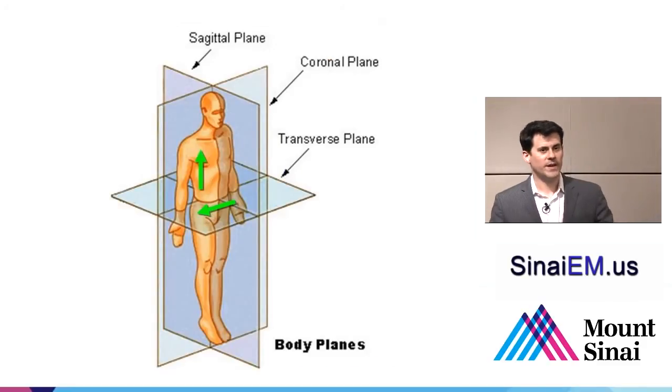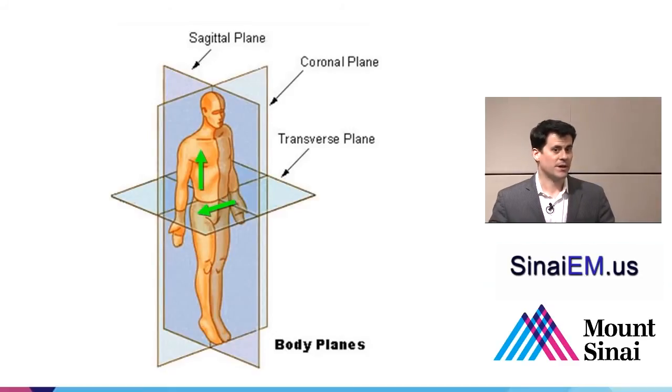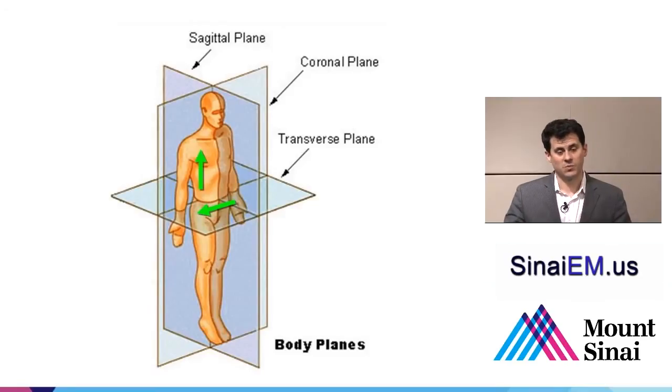And the reason why we don't lose track of it is because there's standard ways that have been developed to hold the ultrasound probe on a human so that you generate standardized images. This way, the images you're generating at the bedside in the emergency department are going to look the same as the images that are being generated in cardiology or in the intensive care unit or in the PACU with anesthesia. They're going to look the same in New York as they do in Boston, and they're going to look the same as radiology. And if you do the imaging properly, a lot of ultrasound images that you generate are actually going to correspond to how CT scan images are oriented as well.